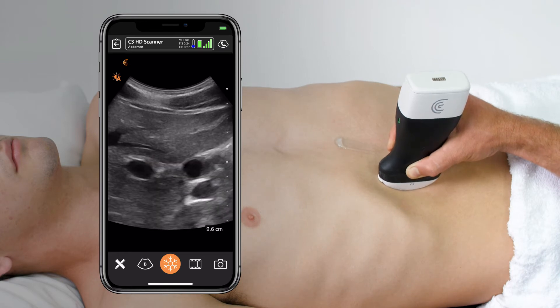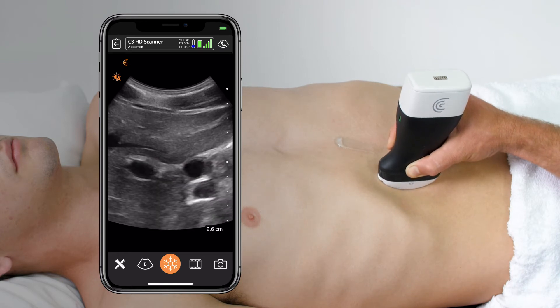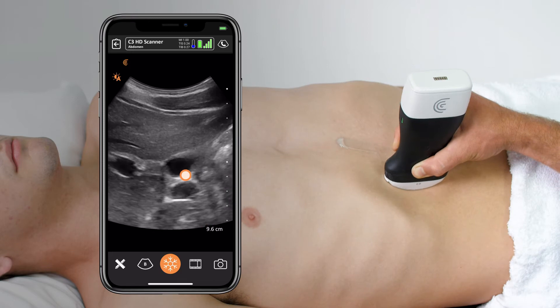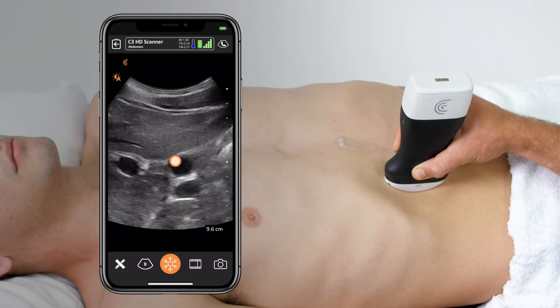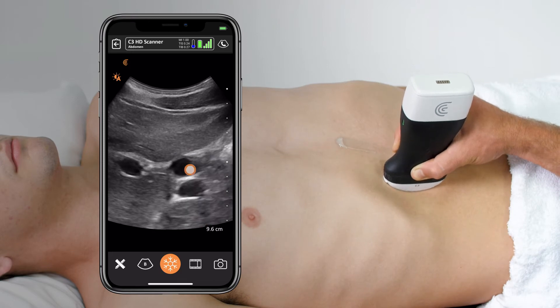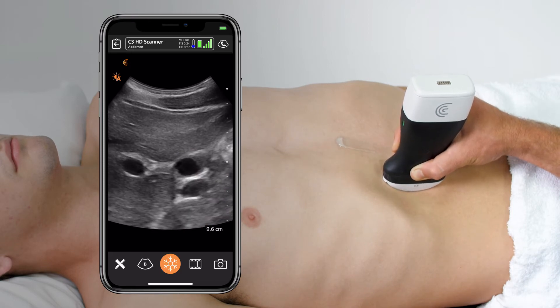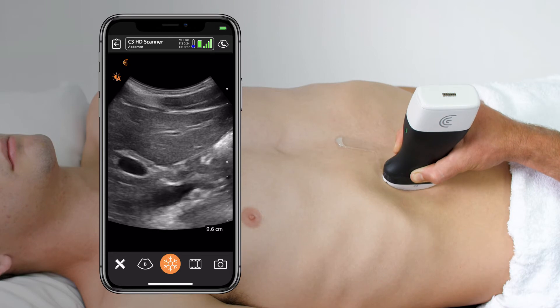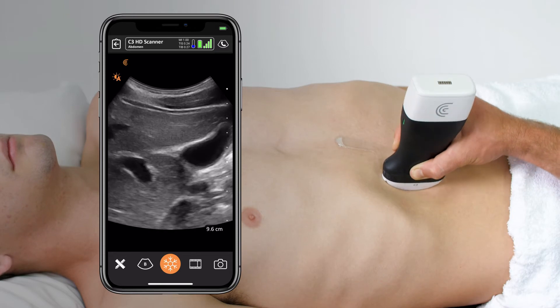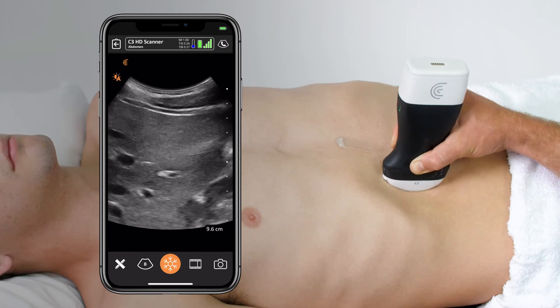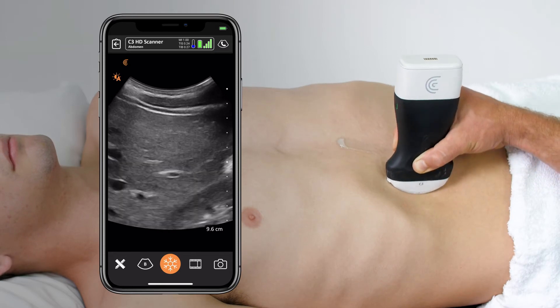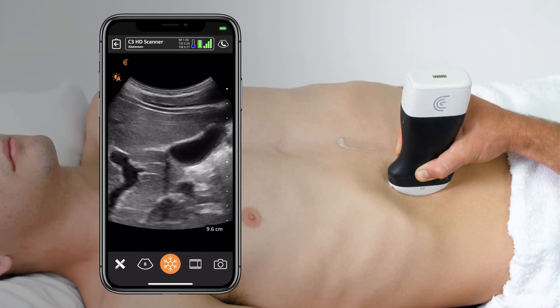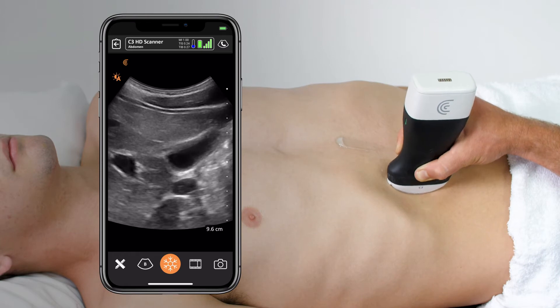Connected to the portal vein on the right of the screen is the gallbladder. Once the gallbladder is in view, I can sweep through it by bringing the top of the transducer all the way over to the left and all the way over to the right, making sure I don't see any signs of stones or inflammation.